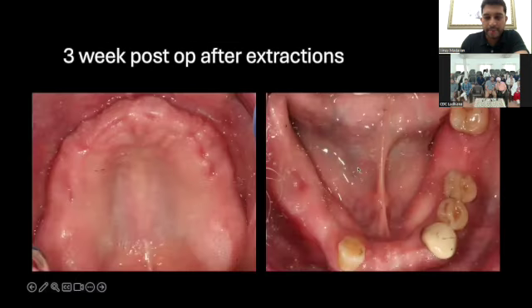Once that was completed, this is phase one, where all the maxillary teeth were extracted. In the mandible, we went ahead and tried to save a few teeth. I really wanted to save the lower right side molar, tooth number 30 in our system, for a partial. It's always nice to have a molar there rather than a distal extension going far back. But unfortunately, the caries had gone too far subgingival, so we had to extract that one.